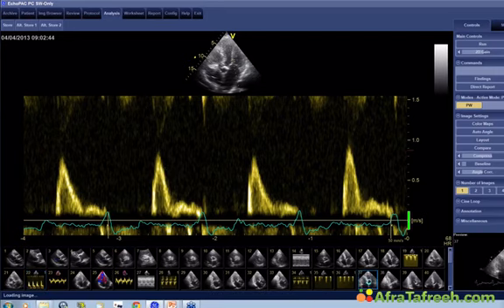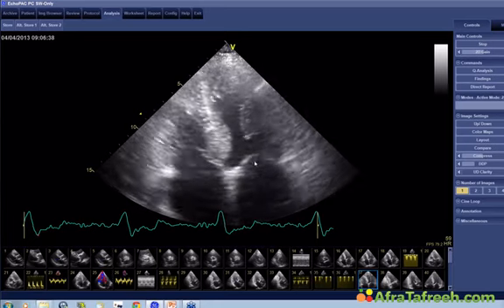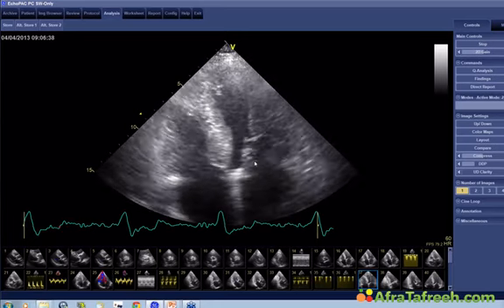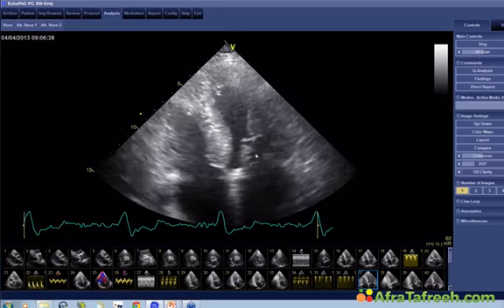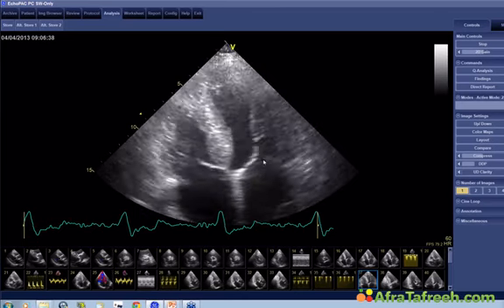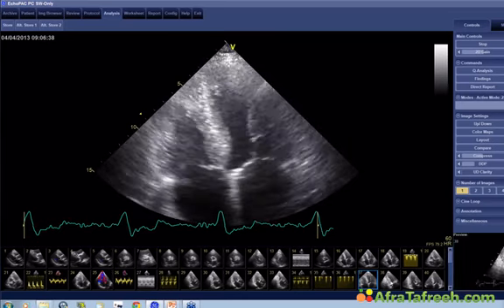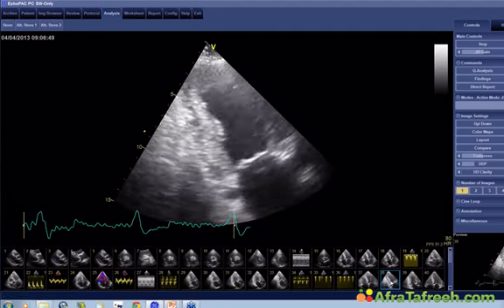Now let's go on. Well, I don't think the patient really has atrial flutter. There seems to be just a very rapid initial motion of the mitral valve, simply because there is very much flow in the early diastolic phase.